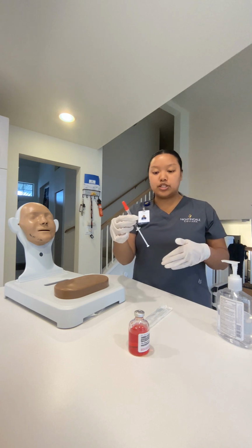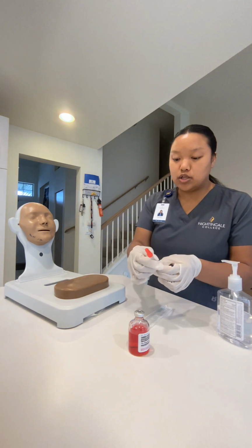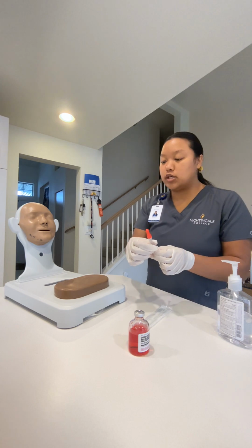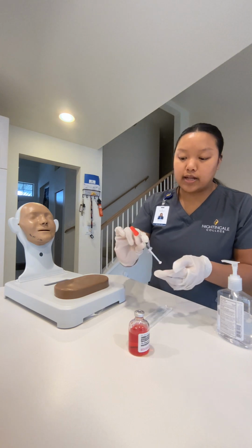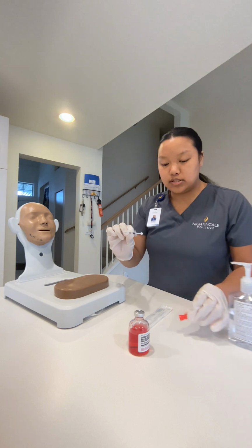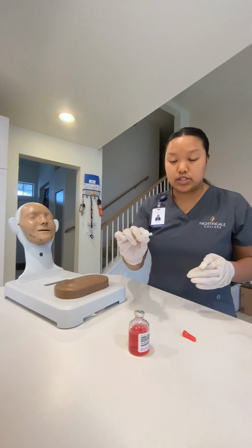This is the right patient, this is the correct drug, and I'm gonna pull 1 mL, okay? Right time, correct dose, 1 mL, and I'm gonna document this, and this is the correct route, subcutaneously, that we're gonna do on her left lower abdomen area, okay? So now that I have the 1 mL, I'm gonna go ahead and uncap this. I'm gonna put this to the side, move the hand sanitizer. If I touch something else, I would probably just get a new glove and do my hand sanitizer again, okay?